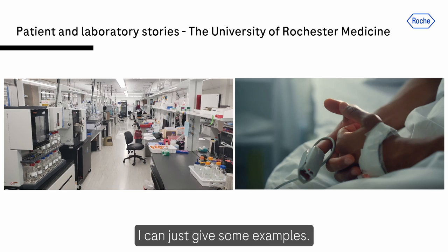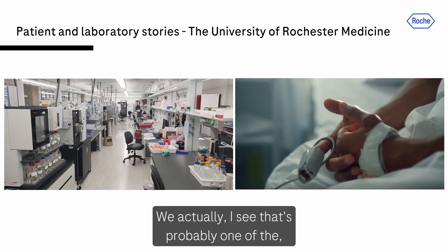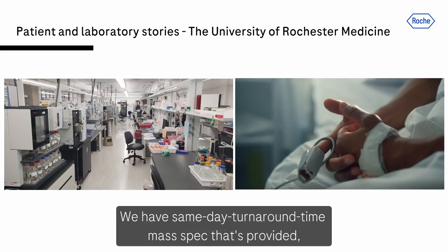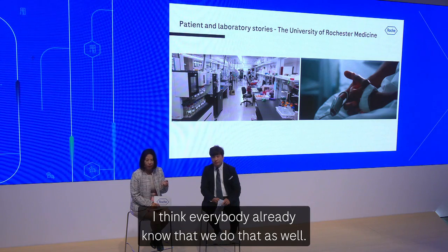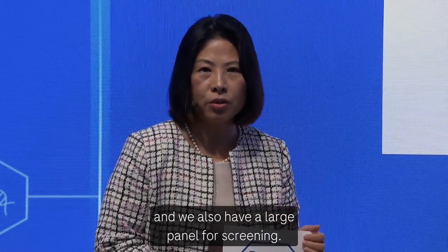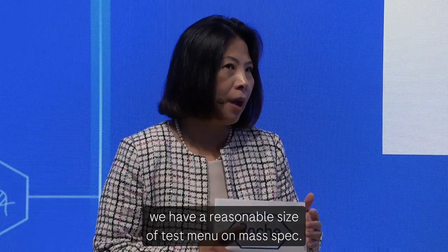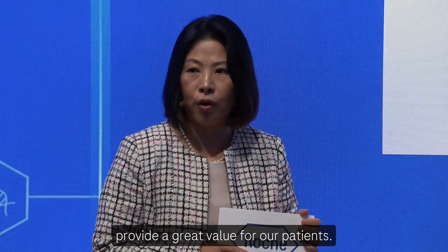I can just give some examples. For instance, immunosuppressant drugs, right? That's one of the common drugs that people use. I call that one of our fast turnaround time assays. We have same-day turnaround time on mass spec, and we do hundreds of tests every day. The other one, vitamin D, I think everybody already knows that. We do that as well. Drugs of abuse, we have that too as a confirmation, and we also have a large panel for screening, and some endocrinology testing as well. We have a reasonable size test menu on mass spec. All of them, I think, provide great value for our patients.